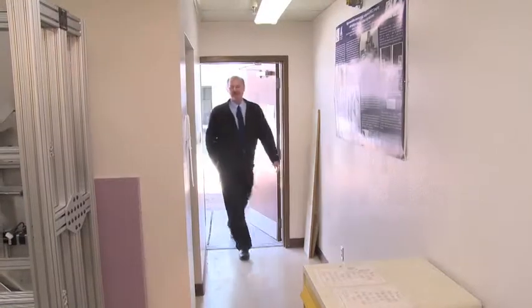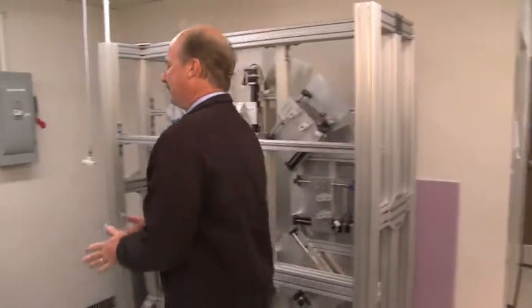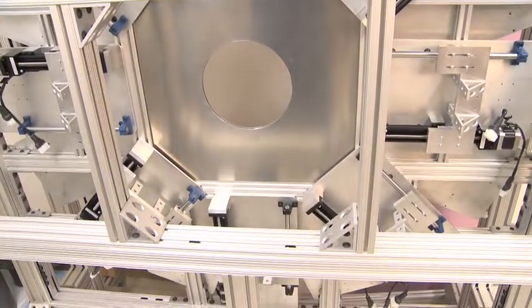In this laboratory, I'm going to show you something that you rarely see, and that's the inside skeleton of our most recent system. This system is called SPECT. In this system, we're working to make the imager itself smart.